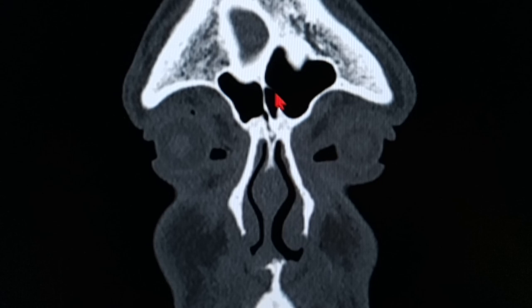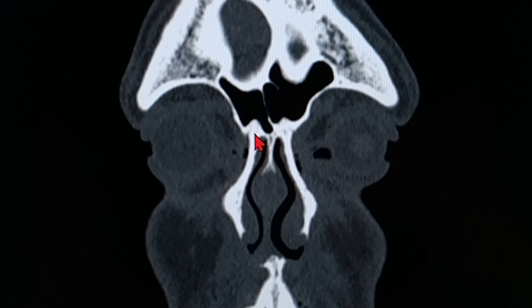So this is the inter and this is the intra septations of the sinus. Okay, you can see the floor is there, perpendicular plate of the ethmoid. So this section is clear. I hope all of you understood what I was talking about, the frontal sinus and the recess.